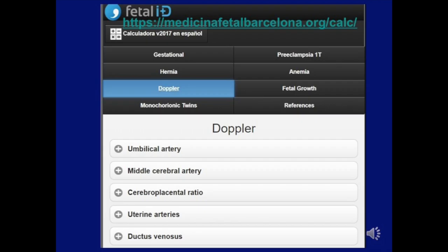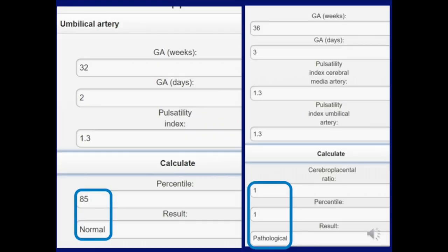Using the perinatology website: go to the Doppler tracings section where you can select umbilical artery or middle cerebral artery, enter the gestational age in weeks and days and the pulsatility index, and it gives you the percentile and whether it is normal. The same applies for CPR — enter the MCA PI and umbilical artery PI to get the ratio, its percentile, and whether it is normal or pathological.